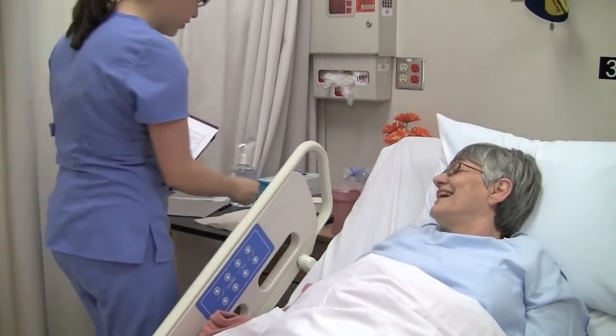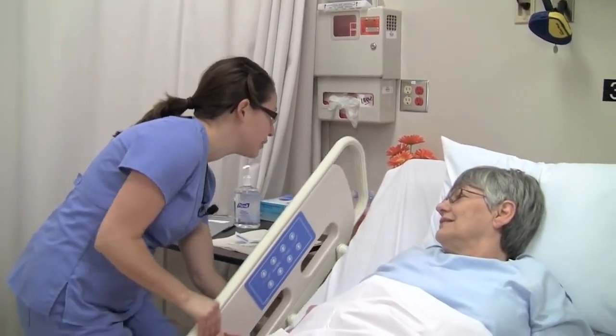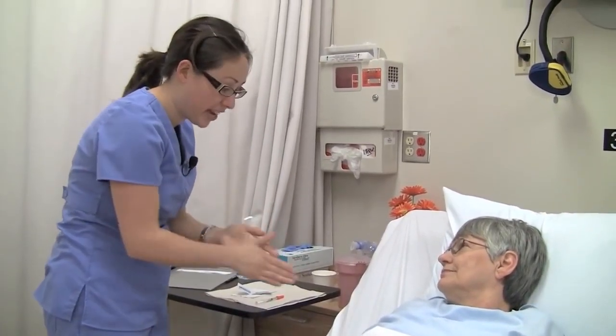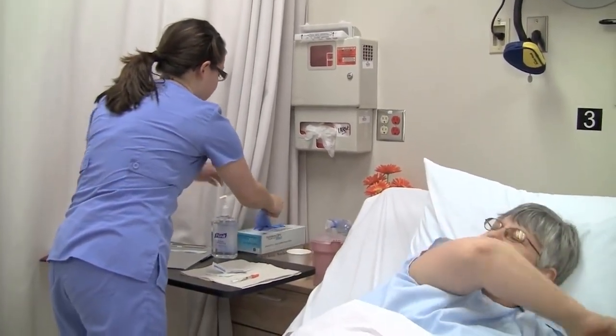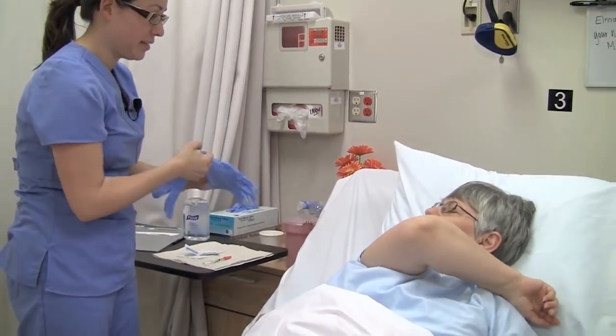Recheck the patient's ID and create privacy. I'd like you to please tell me your full name and date of birth. Alma Jones, 2638. I'm just going to lower this side rail here. Wash your hands. I'm going to wash up my hands, and I'm going to need to have access to your arm here, so I'd like you to raise your arm up. That's great, Alma, thank you so much.